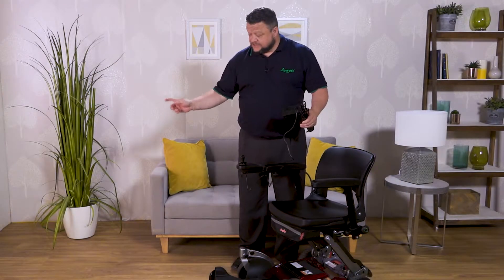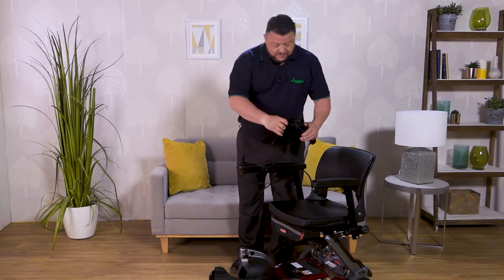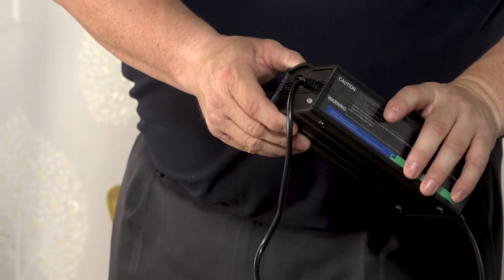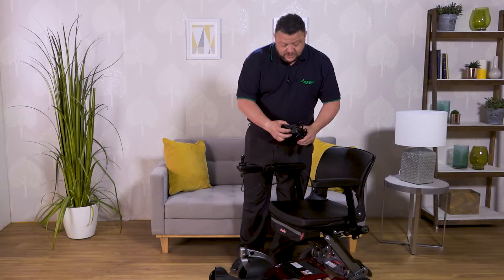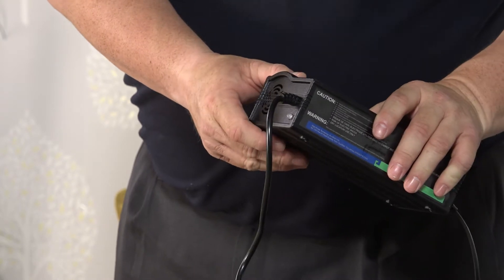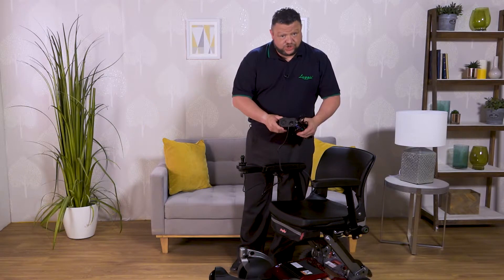Once we've plugged it into the mains, we switch the mains power on. Coming back to the charging unit, when we switch it on, we have a small indicator that will initially go red, then it will turn amber and you will hear a small fan start to work. When your light is amber and your fan is running, that's when you know your Leggy chair is charging.